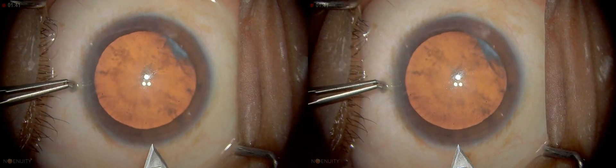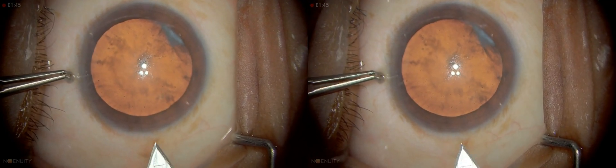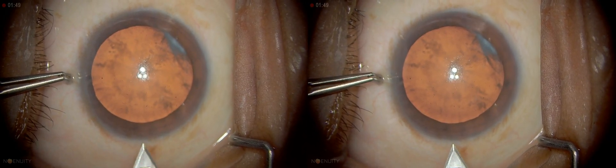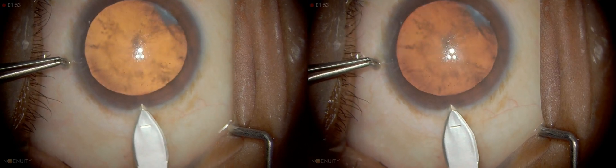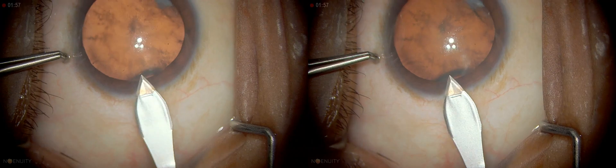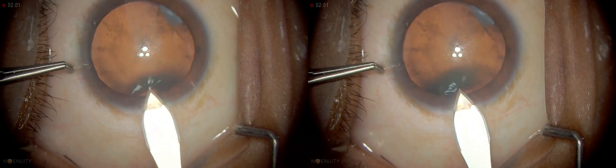When you do go in, keep the blade not tilted but almost horizontal and press down a little bit before initiation. Gently push the blade through until you come up to the mark. Once you reach that mark, depress it down a little bit and then smoothly enter.